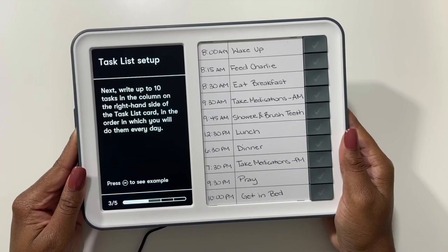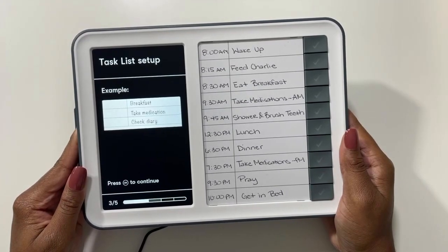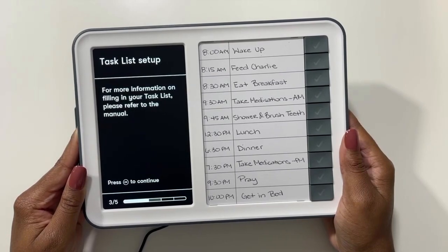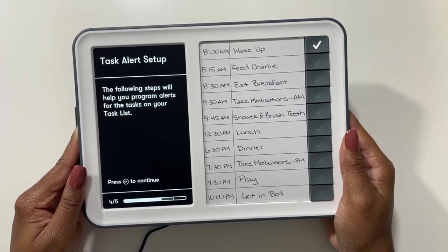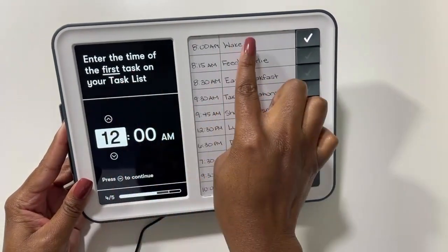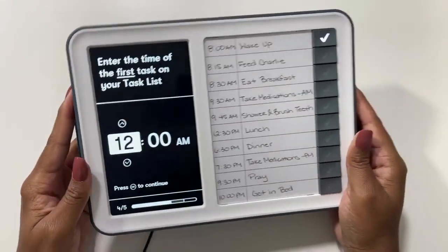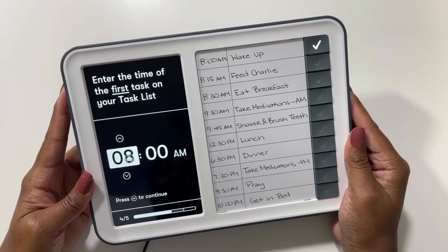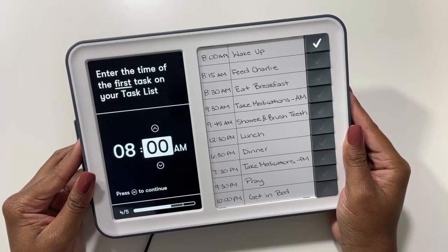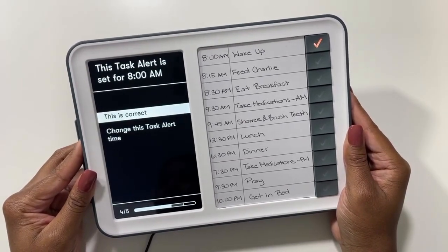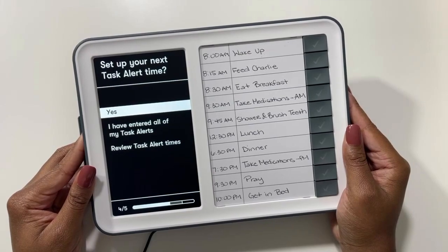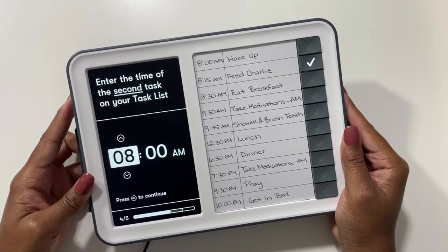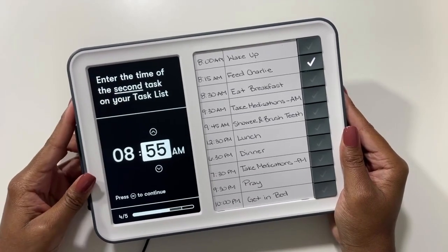These next prompts will guide you through what we just did. Now we want to enter the time of our first task by using the arrows and hitting OK once we get to our time. Then we will repeat the process until all of our tasks have been added to the device.